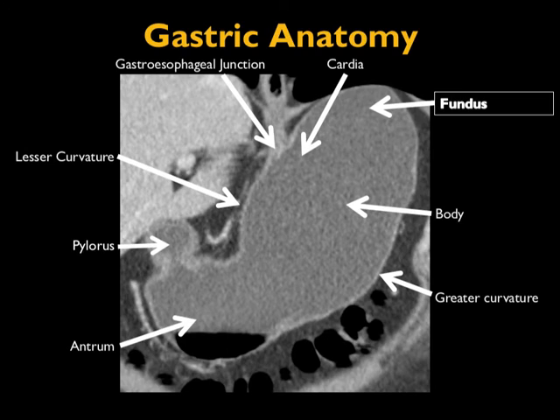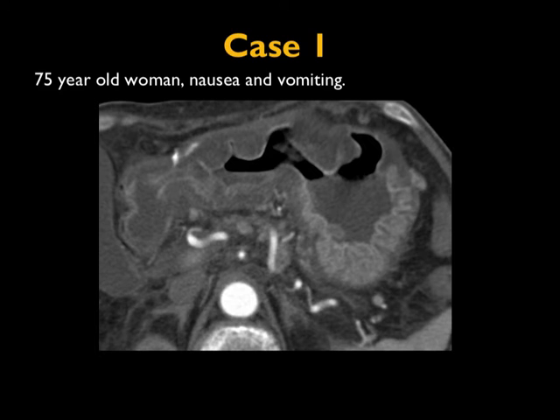Looking at this first case, there's no doubt there's marked gastric pathology, particularly in the body and antrum. There's diffuse wall thickening with low density. Could this be carcinoma? It could, but with carcinoma or lymphoma the wall is usually more solid in attenuation. The low density here makes me think about edema, which would favor inflammatory disease.